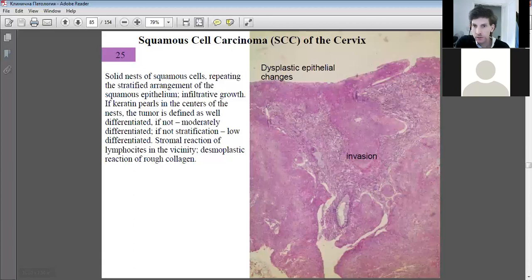This invasive tumor has grown from a nest, so that's not a nest as such, but there's one. There's one. So basically the nests are starting in the epithelial squamous area of the cervix. Okay. There's another example of a nest there, but it tends to be at the top here.